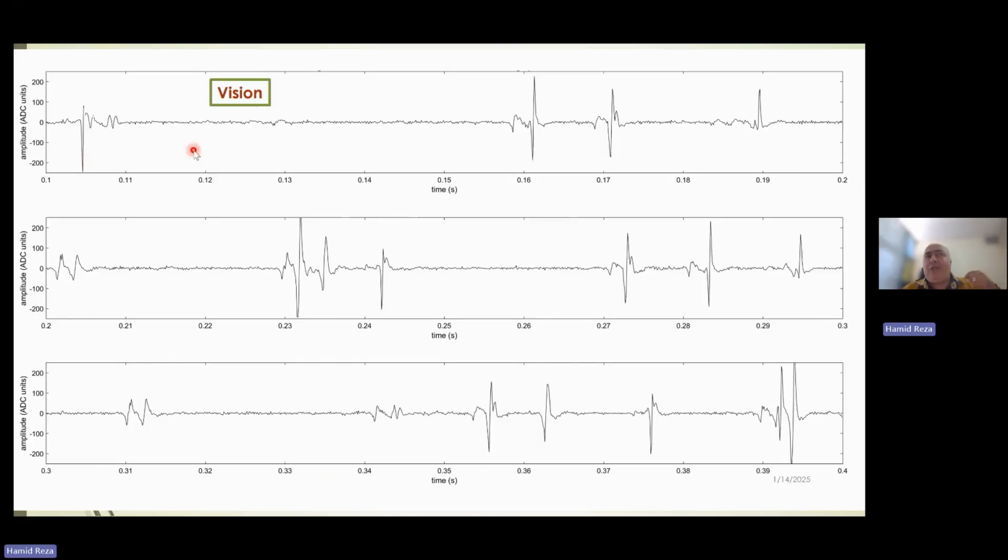It is because when you listen to the sound, you are able to identify if the contraction is constant, if something's wrong, or if you need to put the needle in another place. So it is a very important section of the recording, as all of the clinicians know, those who work on neuromuscular disorders, on conduction velocity, people who work with needles, they look at the signal and they listen to the sound.